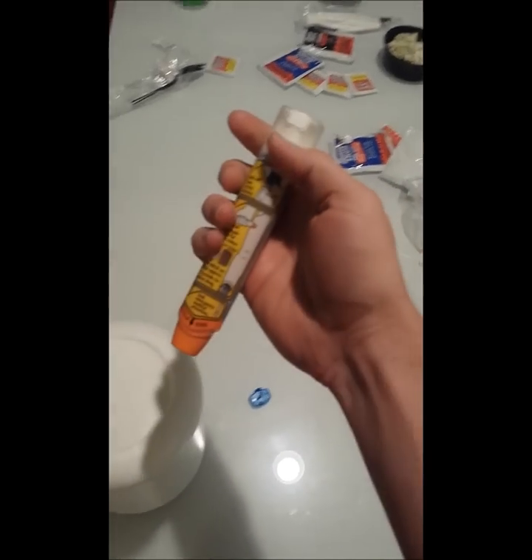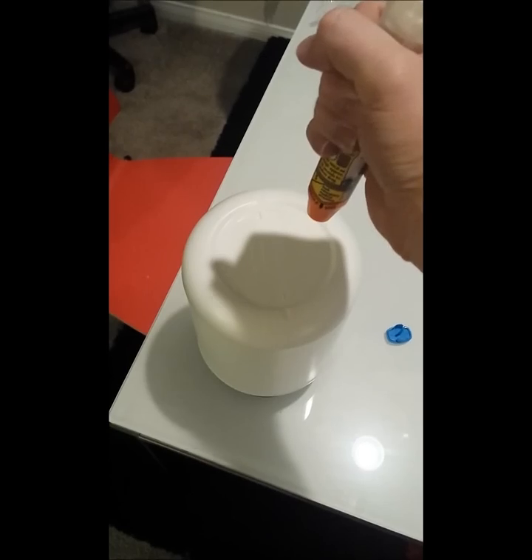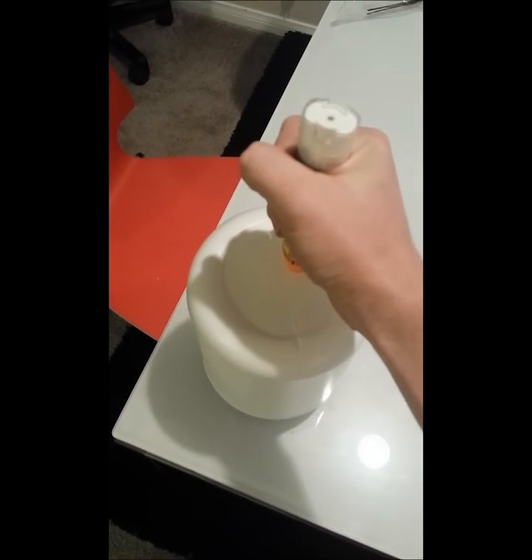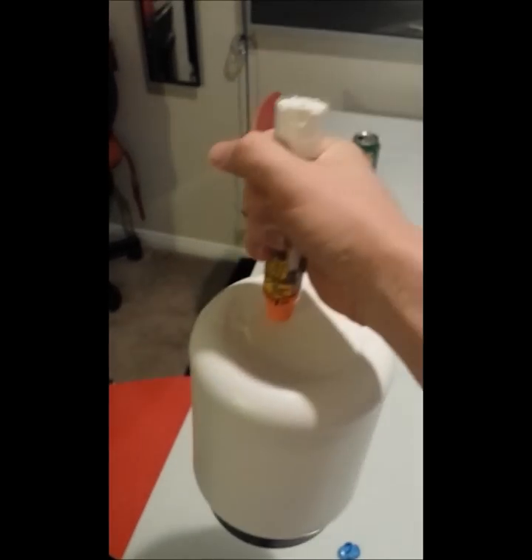So now it's loaded and ready to go, and I'm going to put it right into the cap of this Muscle Milk container here. Let's take a look at what it looks like when it's done. As you can see, it stabbed right into the Muscle Milk container, and let's see what the needle looks like afterwards so people know what they're getting into.